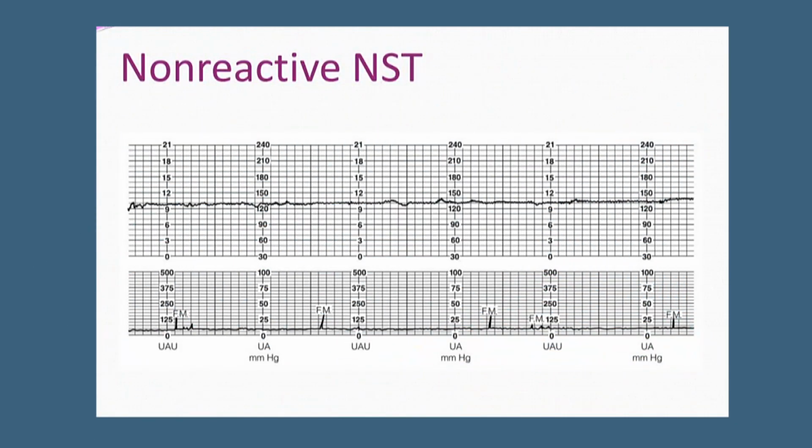The strip of a non-reactive test will be displayed on the screen. You can watch it.